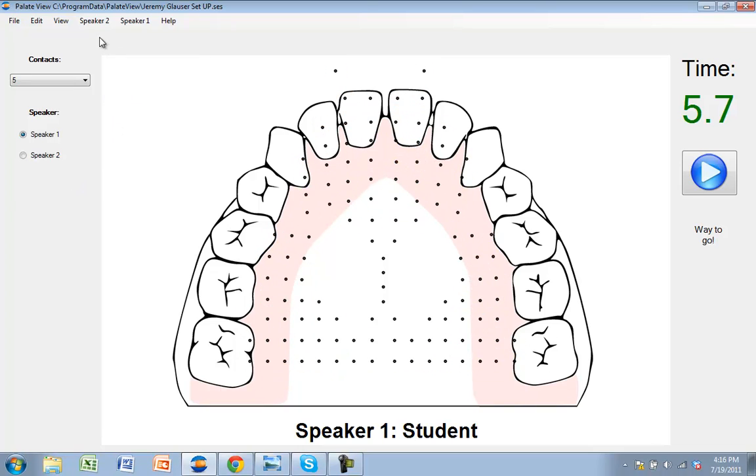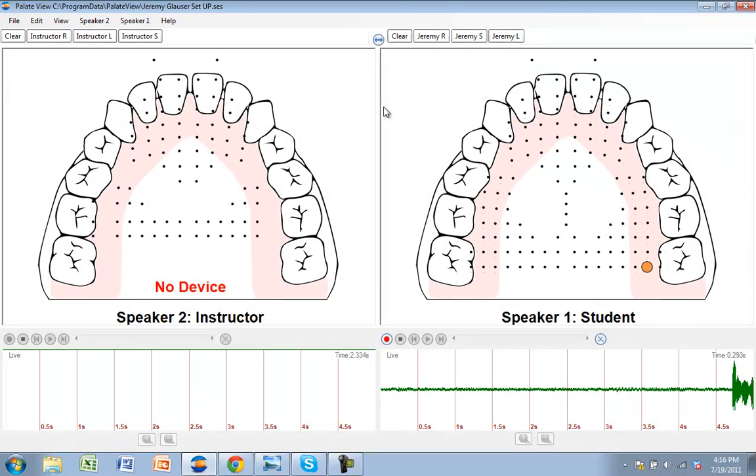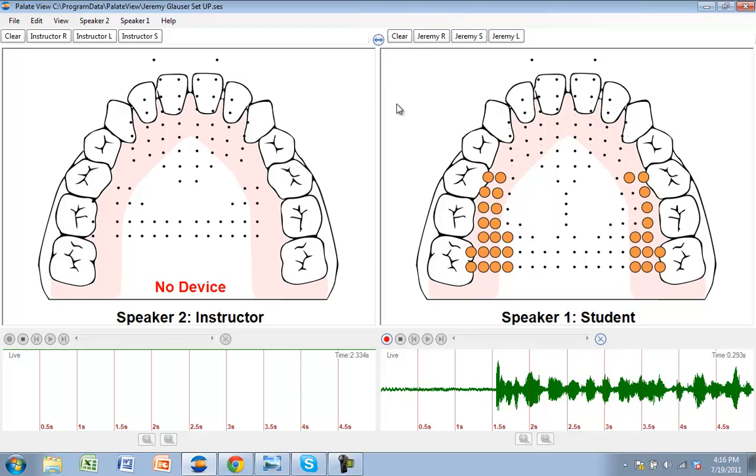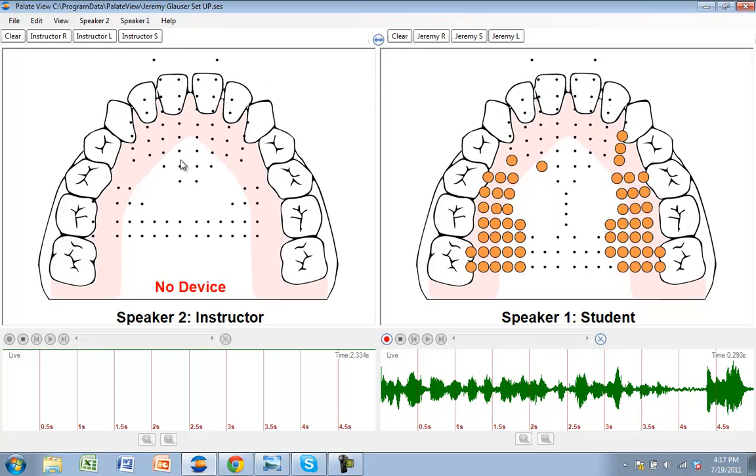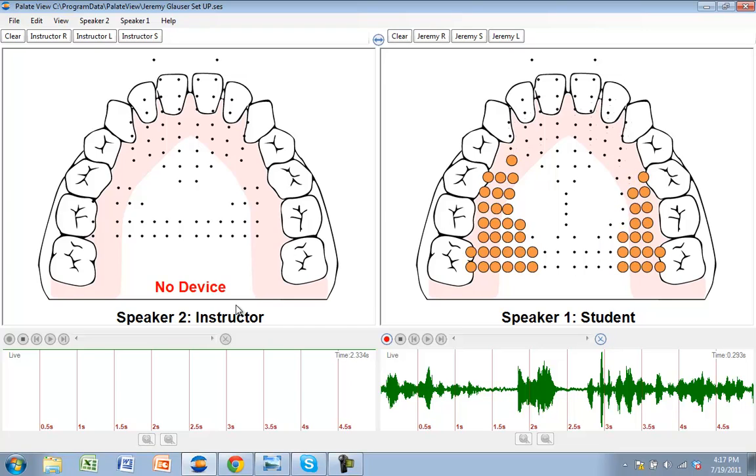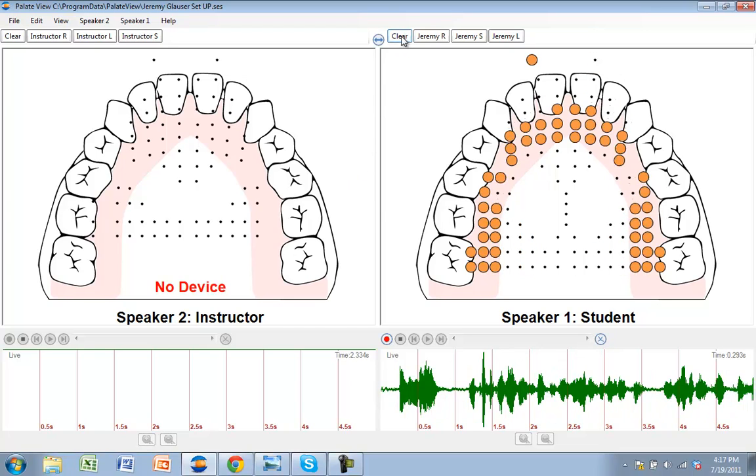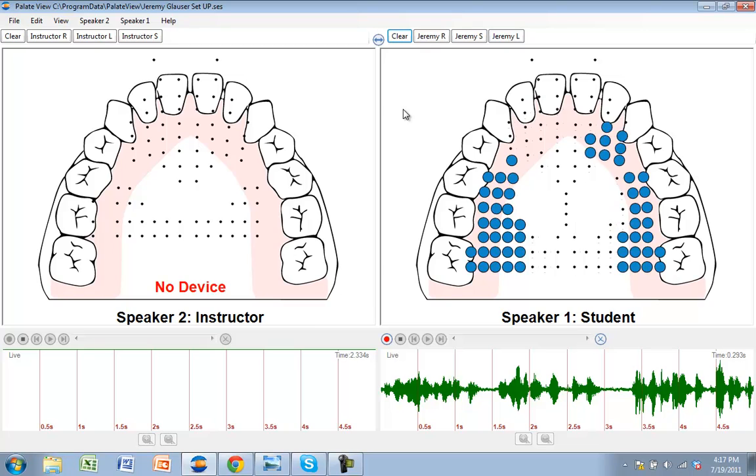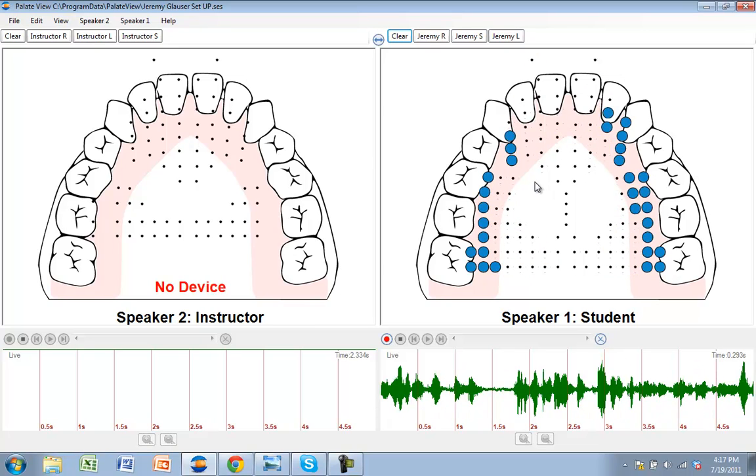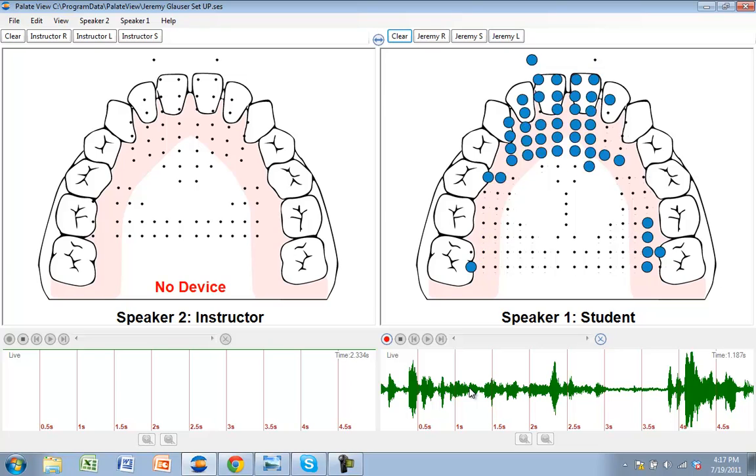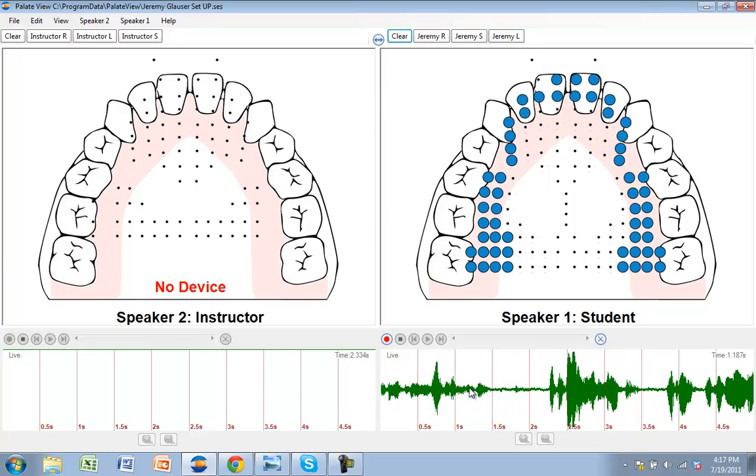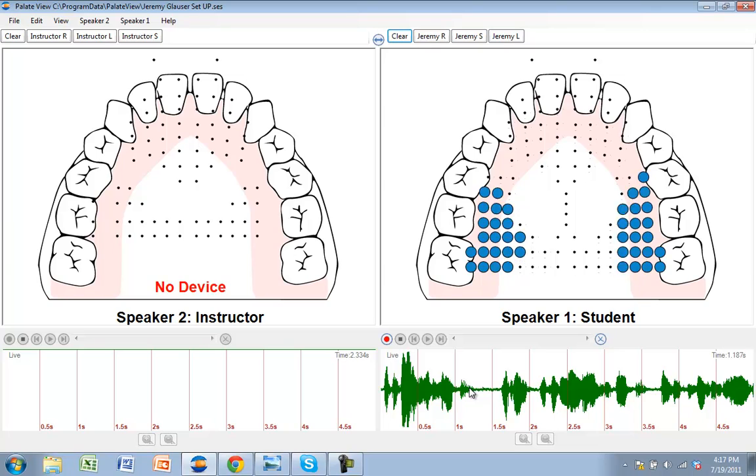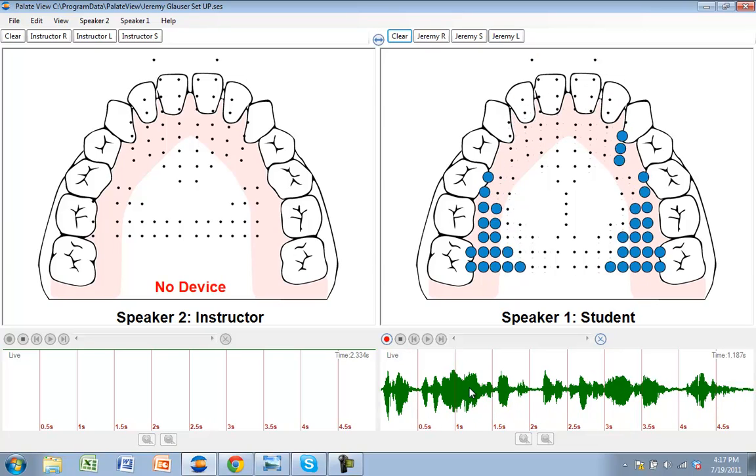Let's go to the final view, and this is the view of the entire palatometer, where you have two palette views next to each other. On the left, you typically have the instructor, or you as the SLP, with your smart palette plugged in so that you can demonstrate proper articulation to your student here on the right side of the screen. At the bottom, you have a waveform, which is measuring the airflow as they're producing the sounds, the words, the sentences.